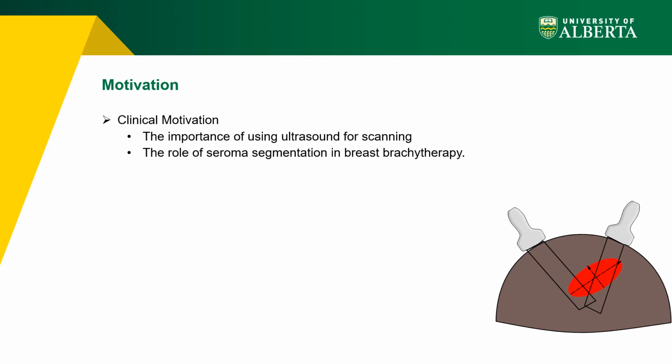Common treatment options for breast cancers are mastectomy, where the breast is removed, and lumpectomy, where the tumor and a portion of adjacent tissue are removed. Lumpectomy is followed by radiation therapy, and the area previously occupied by tumor is filled with a body fluid called seroma. The seroma needs to be segmented for accurate needle insertion during radiation therapy. This motivates us to propose a US scanning algorithm for breast that guarantees the visibility of the seroma inside the ultrasound frame.